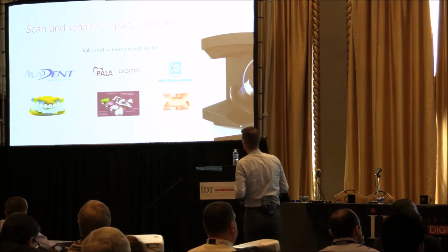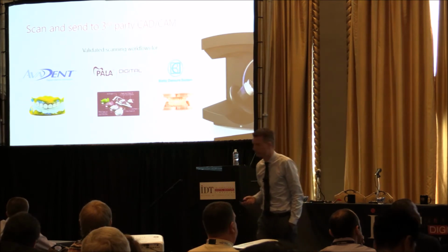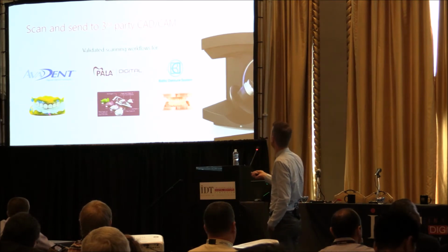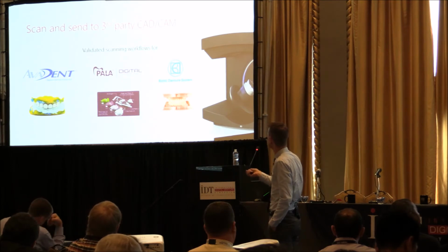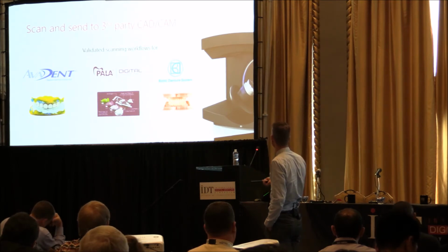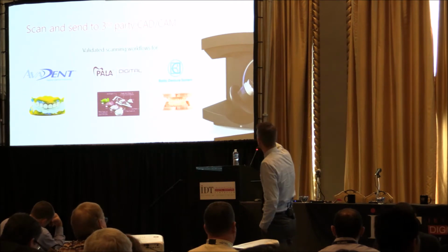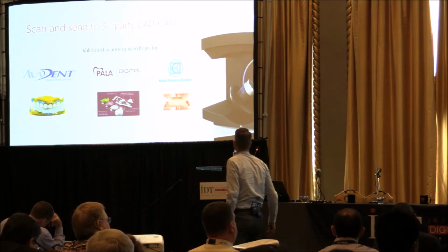All right, again, there are the different options. And I'm not sure how many of the other scanners can do it, but I think most of them can. But you can basically scan, and at least there are validated workflows from 3Shape. So you can scan to Ivoclar, you can scan to Pala, you can scan to Baltic Denture in most of the scanners, I think. And you can basically send it to them if you want and just do the scanning. We can at least do that.